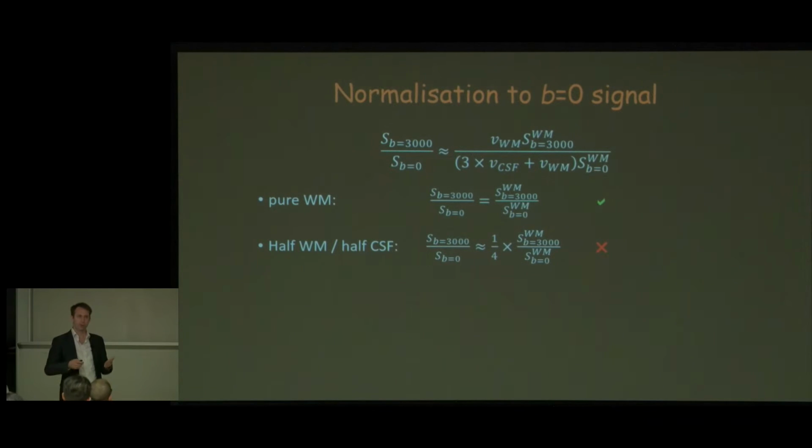And it's all about the fact that you've got very different sensitivities to different compartments because of their different T2s. It makes a massive difference. So I'm not saying that not normalizing is the answer, but certainly I think normalizing to the B0 signal has problems that need to be really thought about. It doesn't make it more quantitative in my mind. I mean, that's a massive problem.